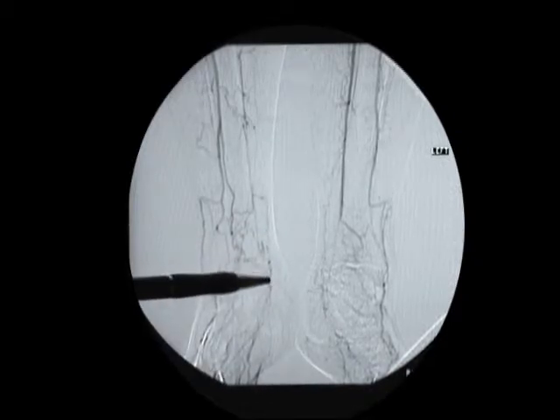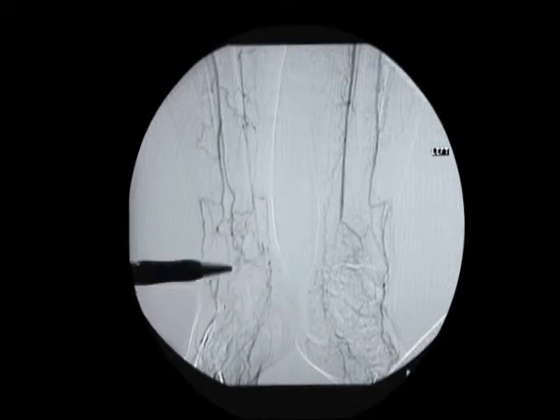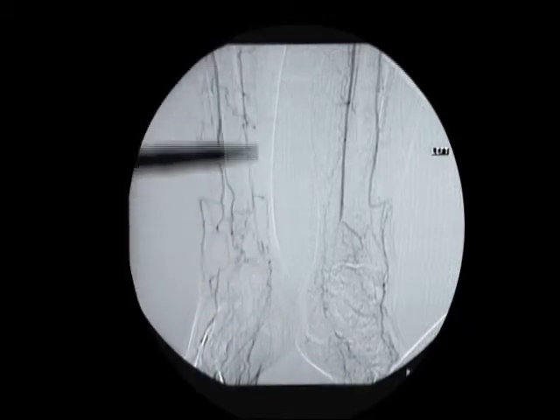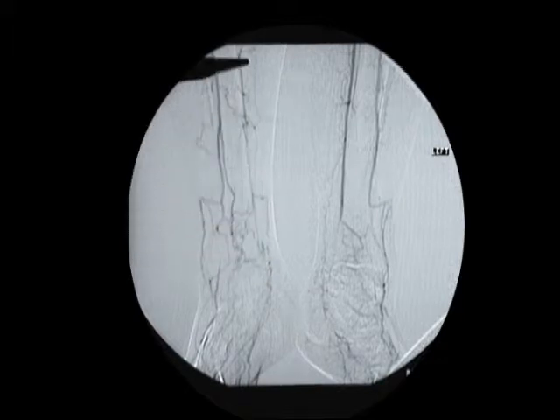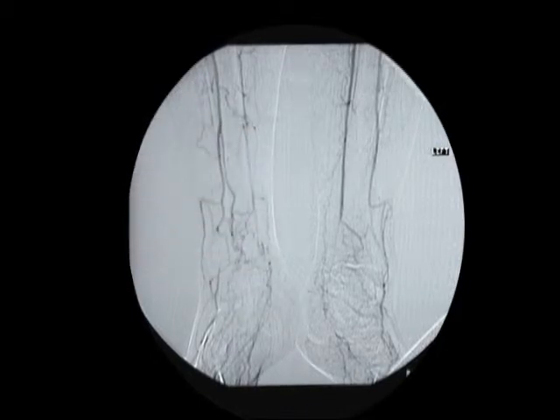In addition, depending on the number of injections which have been consumed in this primary distribution, one would also distribute additional injections up the posterior tibial distribution, concentrating primarily on the distal aspect where the ischemic gradient would be considered the highest.